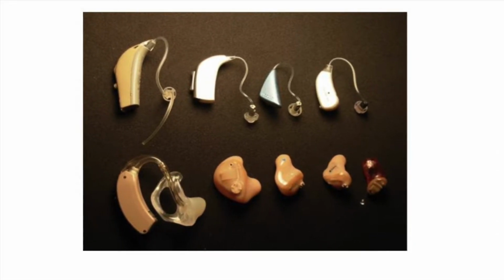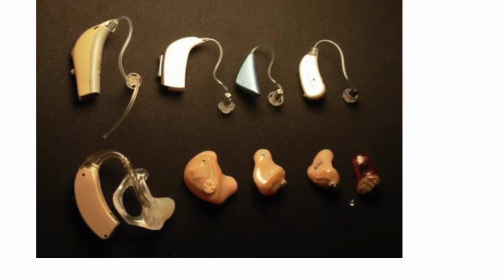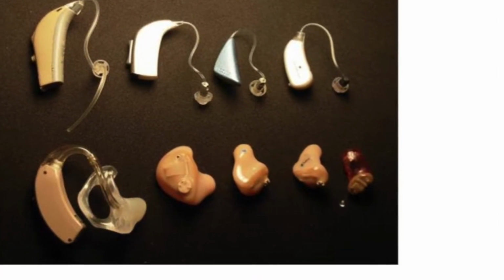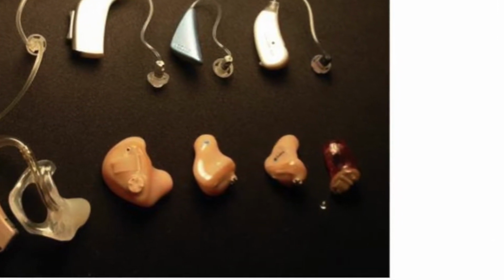That's one of the first and foremost ways that we treat children with hearing loss that's due to some type of inner ear issue or problem. We'll try amplification and hearing aids. There are many different styles and sizes of hearing aids based upon the age of the client, the needs for their hearing loss.